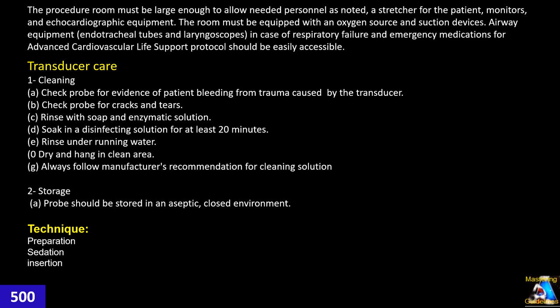For insertion, it again depends on the facility. Some facilities use a condom. They fill the condom with sterile gel and then cover the probe with that long condom. Many places don't use a condom and just insert without one. If the patient has a high risk of infection, such as blood-borne infections like HIV, hepatitis B, C, it is better to use a condom and be careful about all sterile technique.